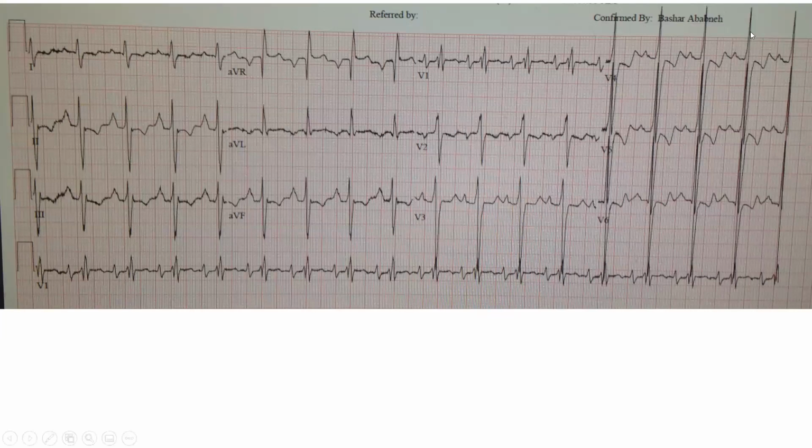Again, despite the age of 66, he has a nice congenital EKG, and I want to show you that. What does he have on that EKG? Any interesting finding? He has a lot of things, but there is one interesting finding. What kind of ventricular hypertrophy he has on this EKG? I think both are hypertrophied, right? Yes, both have hypertrophy.